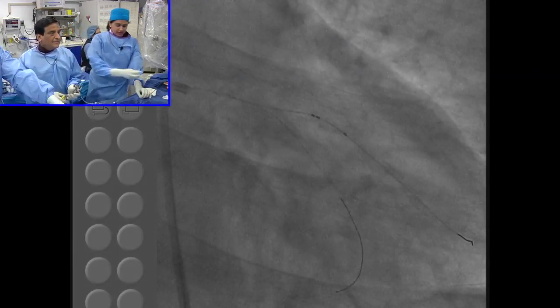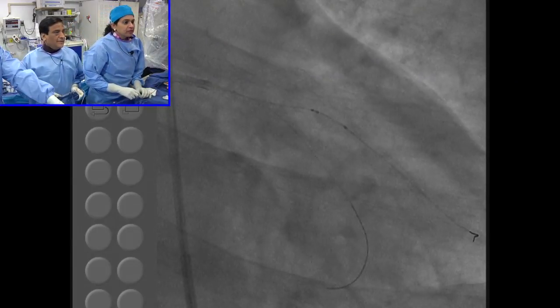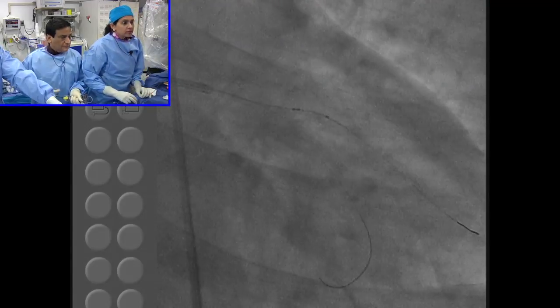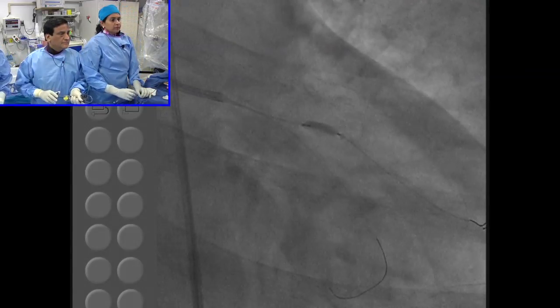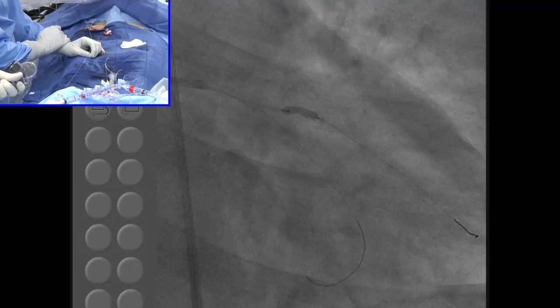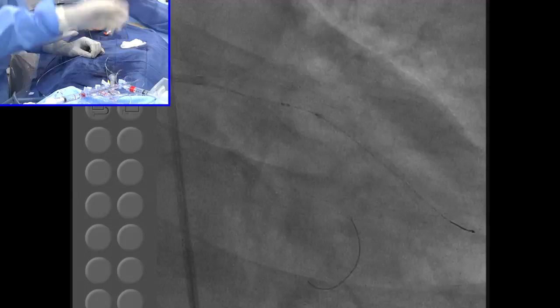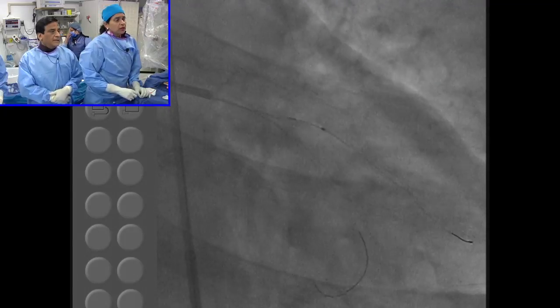Okay. Now what? You need to go a little further. No, we are good here. Good. Good. Go up here. Done. So what do you want? You want to put a 2.5 38, right? Yeah, that's fine. But first we open into this vertical lesion.